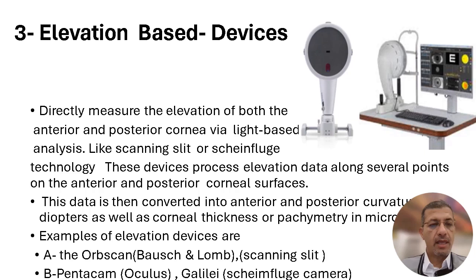So the new machines incorporate both the curvature-based along with the elevation-based or projection-based, so that they have more detailed information and a real representation of the surface of the cornea, as well as the posterior surface and beyond the posterior surface of the cornea.